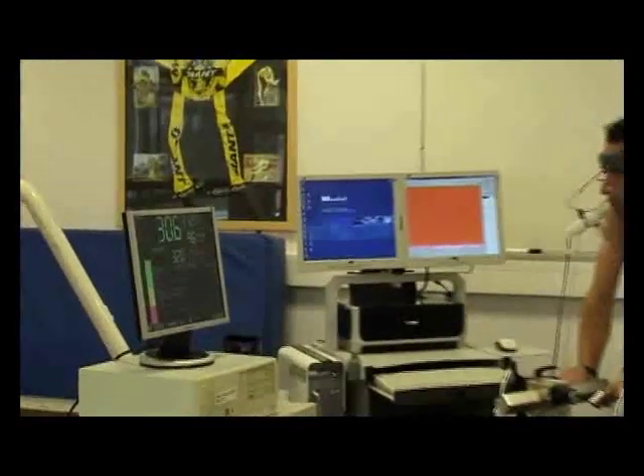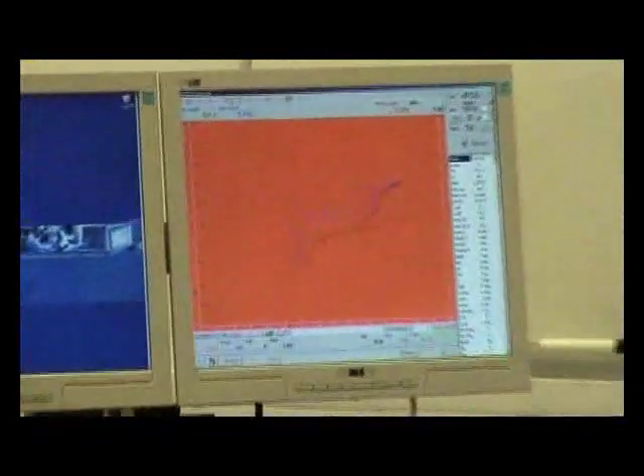By 300 watts, the athlete is now consuming nearly 4 litres of oxygen and shifting about 100 litres of air in and out of his lungs each minute.